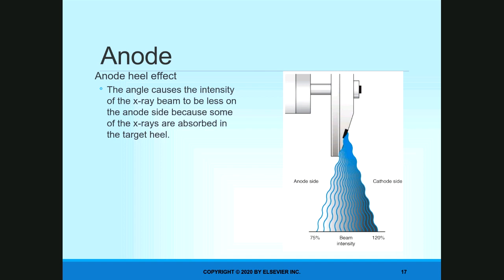Now, the reason that's significant is because we said that if you are creating X-rays, 99% of what you create is heat, only 1% of that is X-ray exposure, which sounds really insignificant, and it is. But if I said that I won the lotto $6.24 million billion, and I was going to give you 1% of those winnings, I don't think anybody would turn me down, because that would be a significant amount of money.